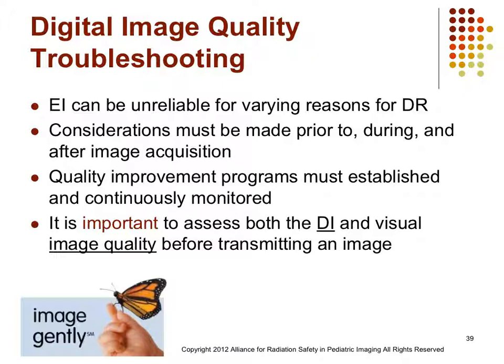So whether we're measuring that physically with calipers or whether we're using some type of digital technology to ascertain what that thickness actually is, and manipulating our techniques accordingly is certainly going to be important when you talk about pediatric patients where AEC may not be appropriate for that given projection.